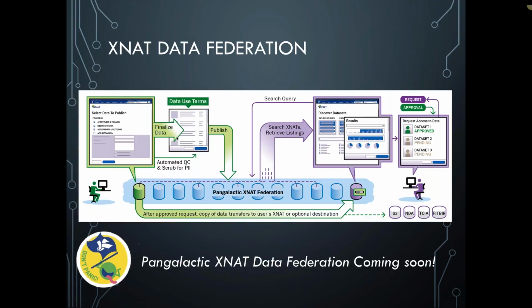We're imagining setting up this kind of federation, not just within a closed network like the DPUK, but globally across all XNAT systems, or at least all XNAT systems that want to participate in a data federation. The idea would be not that data within those systems would just automatically be accessible to all users, but that if an investigator wants to opt in to sharing their data, summary information about their data set would be published onto the federation. Users would be able to issue queries across the metadata, not the actual data, but metadata.